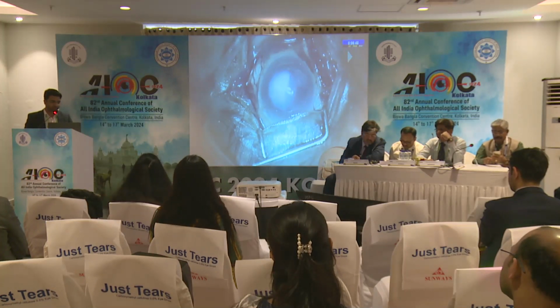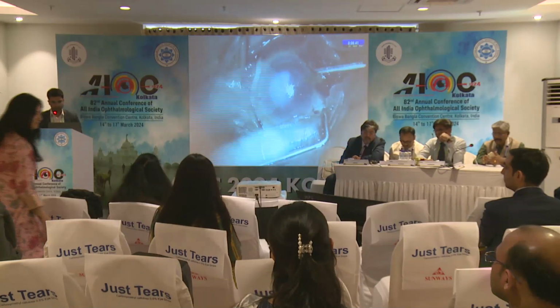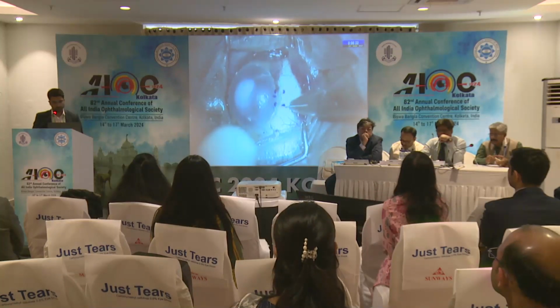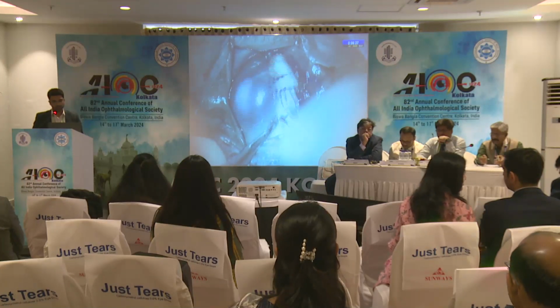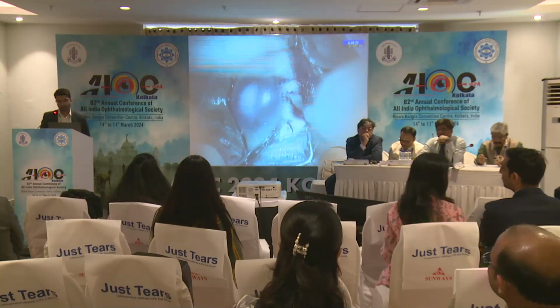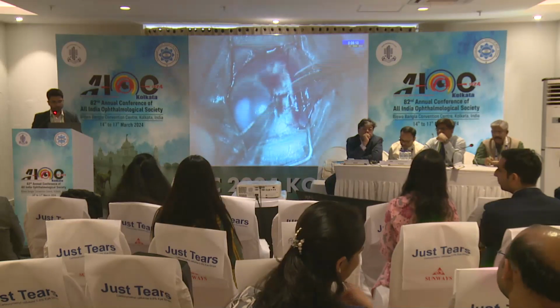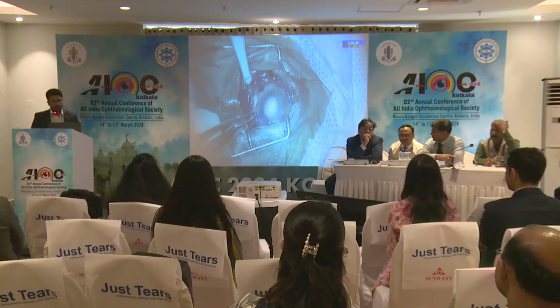So I'm presenting the video. Scleral vessels were cauterized with bipolar wet field cautery. The area of the scleral flaps were marked with gentian violet, and initial partial thickness scleral incisions were made with a blade breaker, followed by partial thickness scleral tunnels with a crescent blade directed inferiorly on the nasal side and superiorly on the temporal side. And these scleral flaps were cut using a Vannas scissors. 3 23-gauge pars plana ports were made.